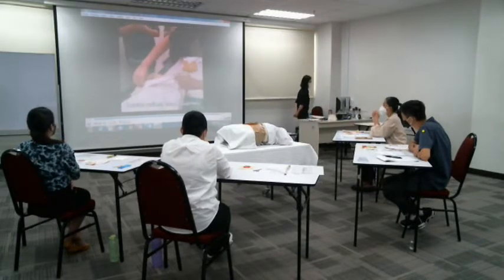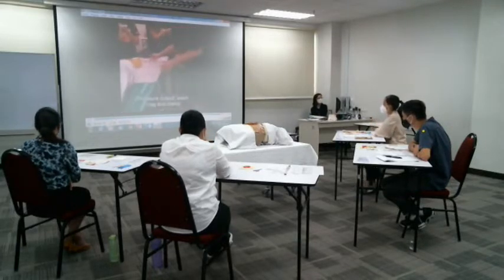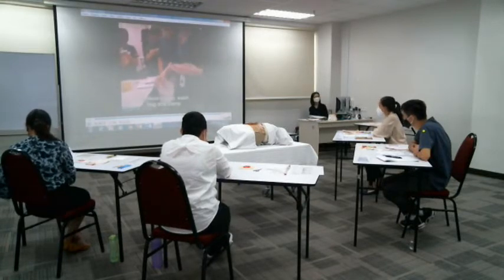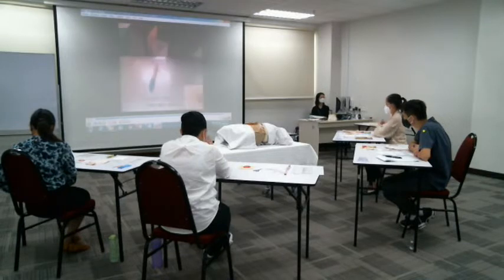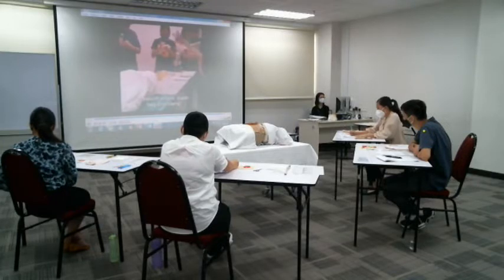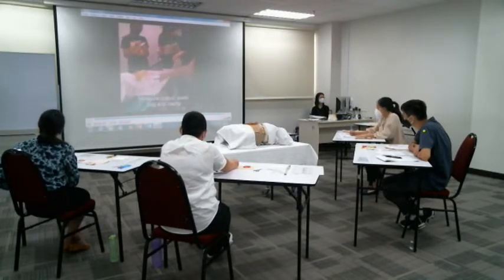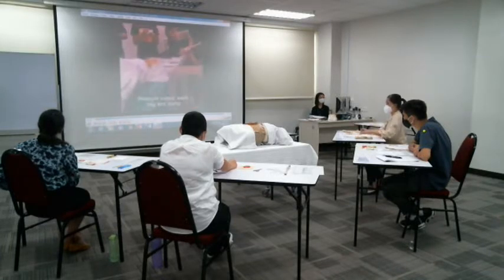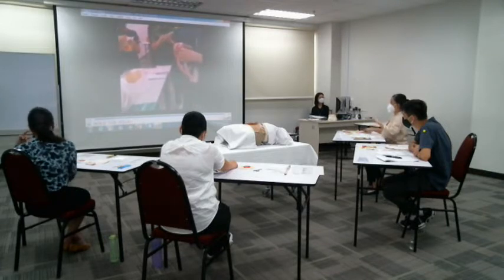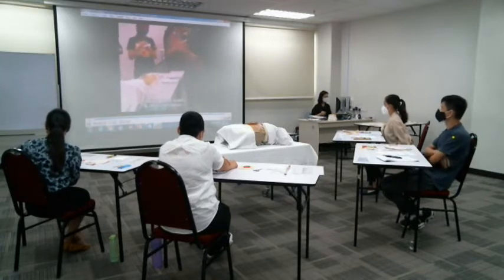Patient. And then clear away all the things. Measure. Take the whole bag to the toilet. If you need to measure, then you will measure. And after that, you rinse through, you clean it, use the tissue on it to dry it, right? And remember, don't accidentally throw away the clamp also. And keep the patient comfortable. Okay? Then after clearing everything, then wash your hands and do documentation.